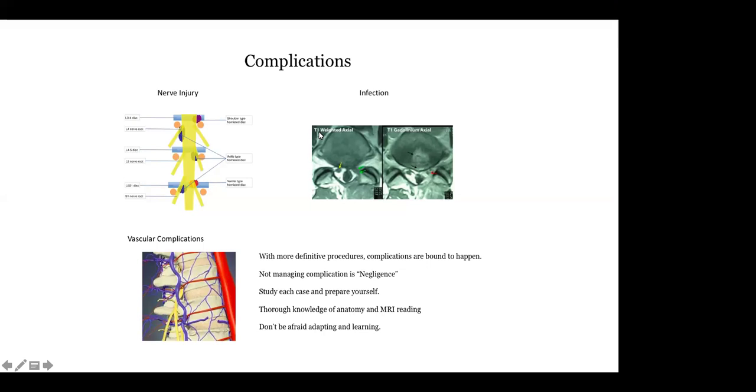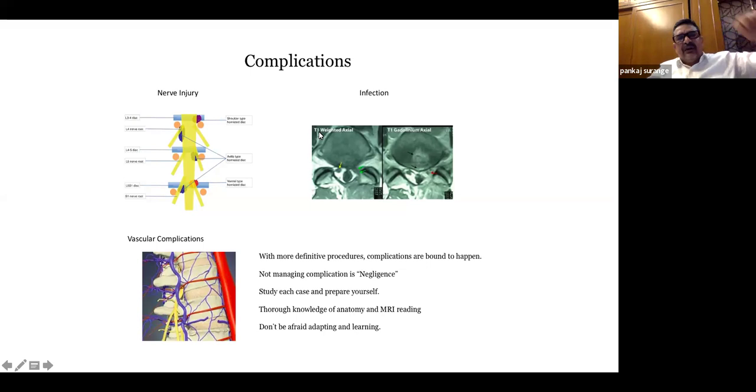Somebody is asking about Tachosil and Gelfoam. I have seen 2 cases in the last 10 years where I sent the patient for open surgery, because in my hospital I call my surgeon also, and I am always there in the surgery. We suture the dura, and over that we put the Gelfoam and the Tachosil. But if it is a big tear, we always do the suturing. We don't just rely on the Tachosil or the Gelfoam.